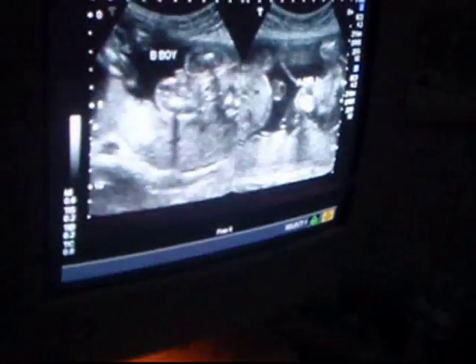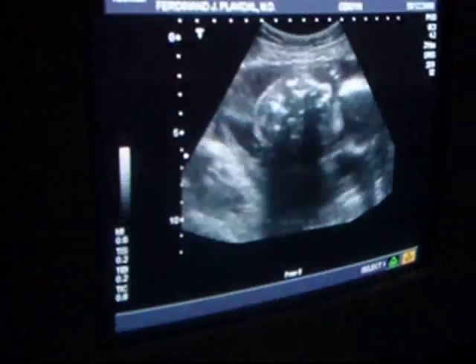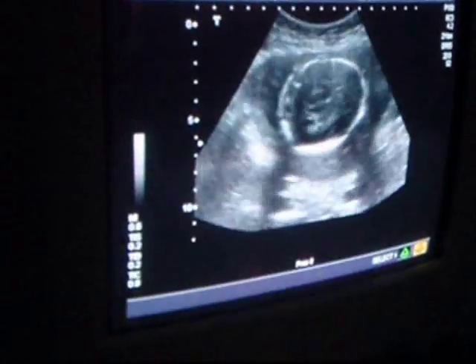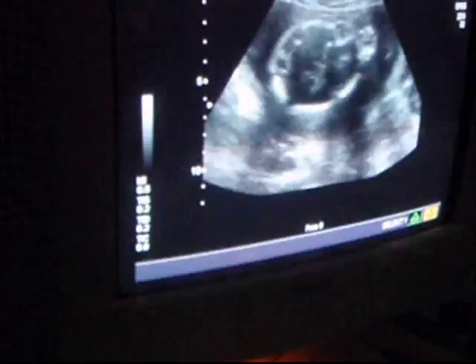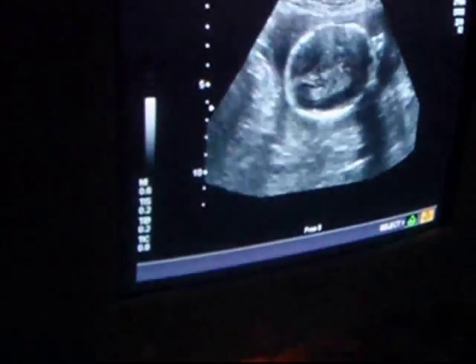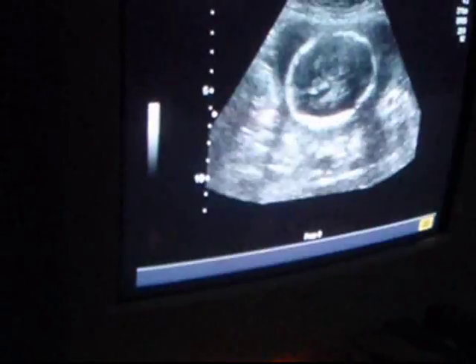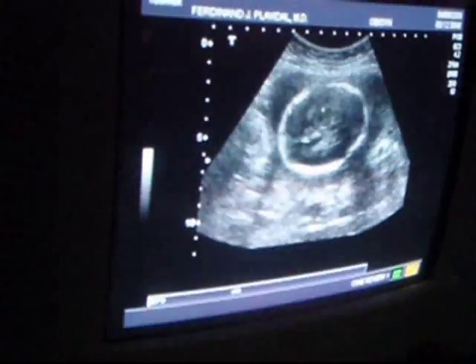Okay, now let's go back to work, single screen, and let's get some measurements. And again, I'm going to start with A on the left, just because that head's a little bit lower, but no guarantees that that's going to be our baby A. Fingers up here in front of the face. And again, as the weeks go by, we're doing less in the line of anatomic survey and more in the line of growth, because anatomic survey days are basically over.